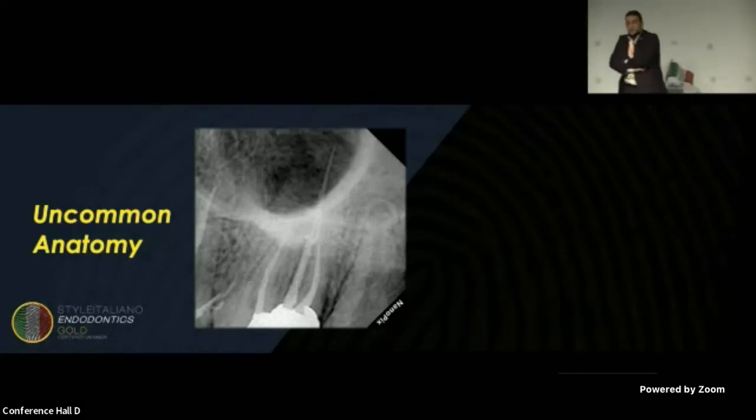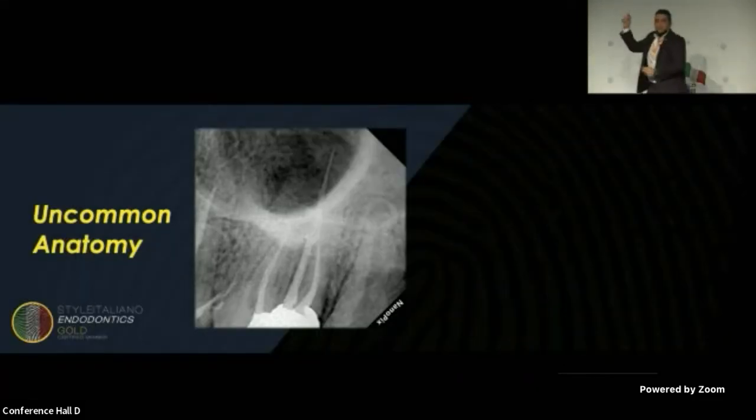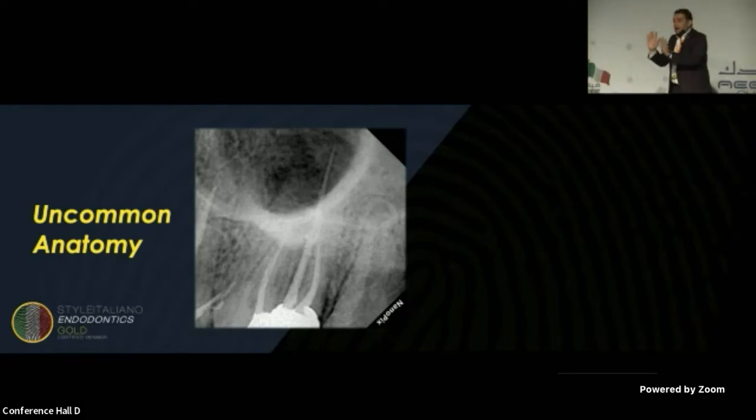And we should identify this in many cases from the pre-root radiograph. If you look here, I have radiolucency beside the palatal root. Yes, we have radiolucency. And you can also notice we have a strange anatomy on that side. So before starting my treatment, I'm trying to look for extra anatomy. And actually, that was easy.